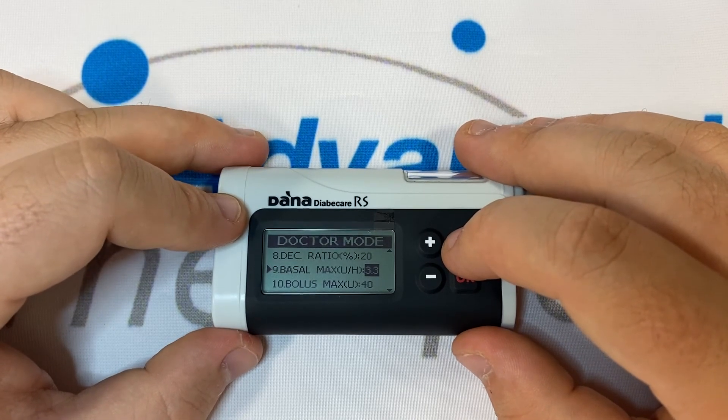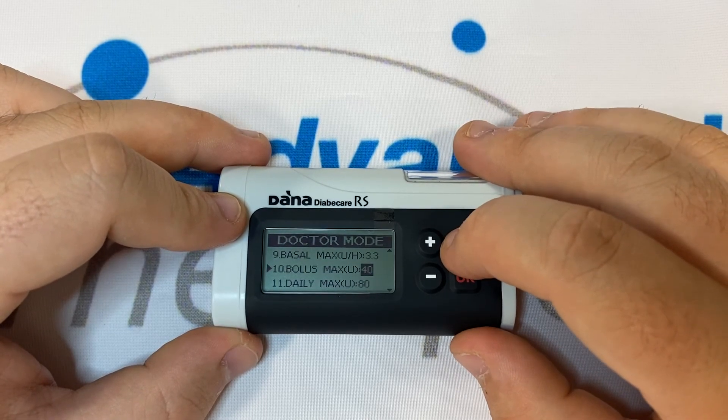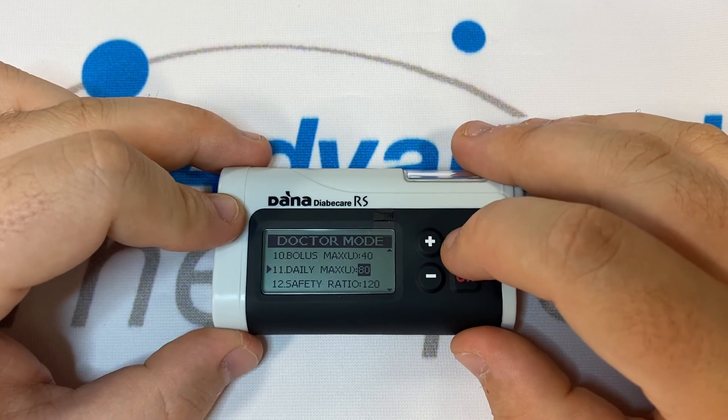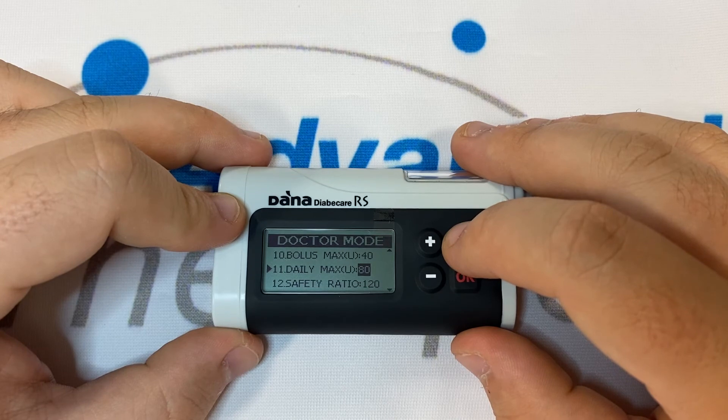Number nine is Basal Max — the highest amount of basal insulin the pump will allow you to deliver in one hour. Number ten is Bolus Max — the largest amount of bolus insulin the pump will allow you to deliver in one go. Number eleven is Daily Max — the combined total of both bolus and basal insulin the pump will allow you to deliver in one day.